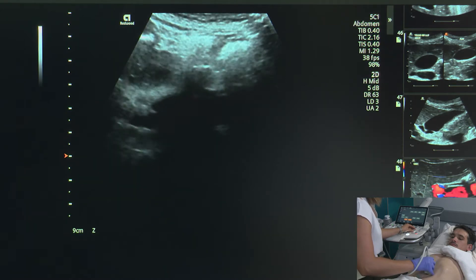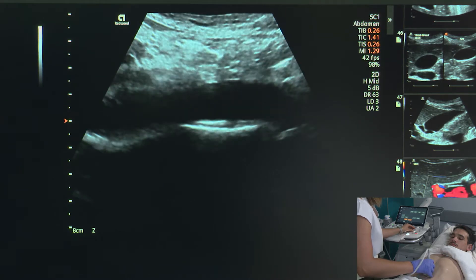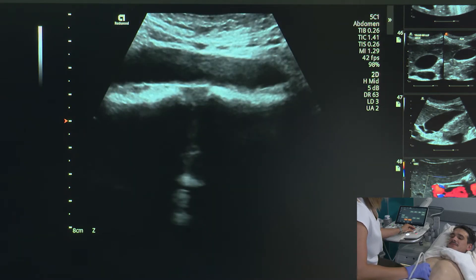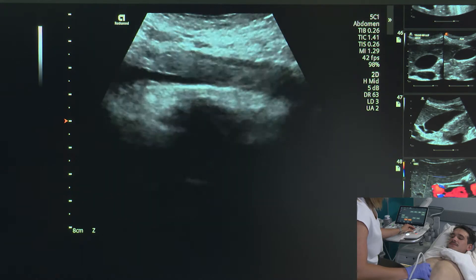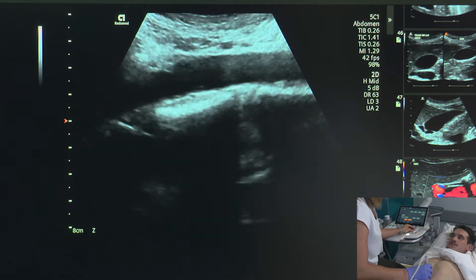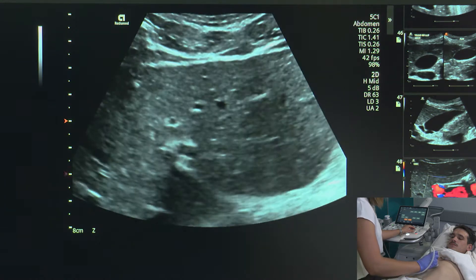At some points where I have a bit more bowel gas, I'm just increasing the pressure. Breathing normally as I make my way through. It's important that I don't interrogate the IVC, which is just right there. I can tell that it's the inferior vena cava because it's not as strong or pulsatile as the aorta. Now I'm ready to go ahead and take some images.